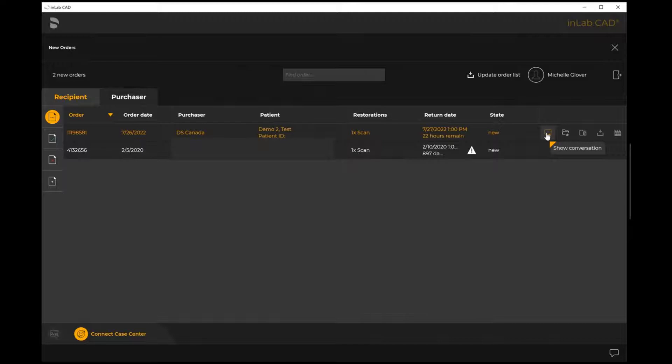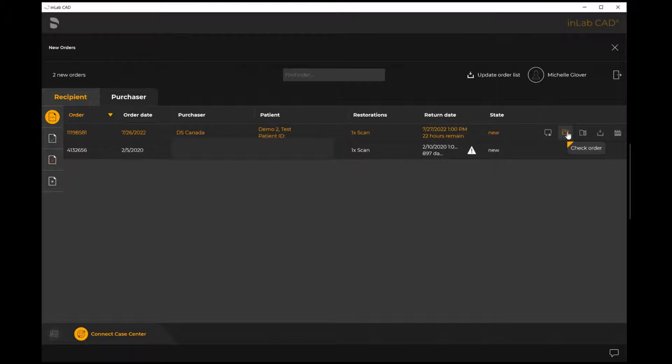Next to that is check order. I'm going to select that in just a moment, but that's where we're actually able to see our scans to ensure that the impressions are adequate for what we need and where we accept or decline the case accordingly.